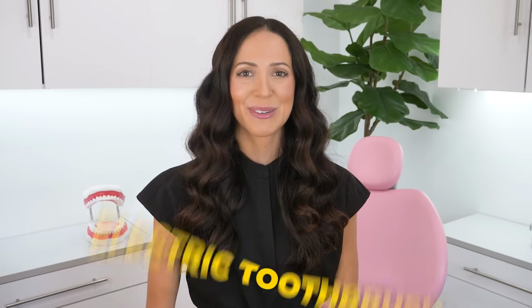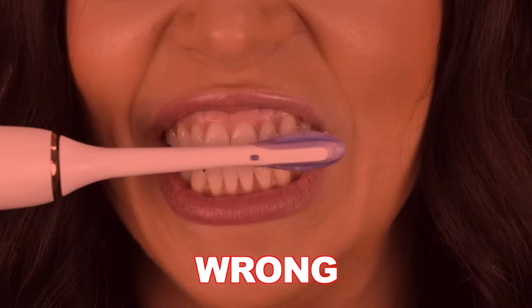And having said that, for today's video, let's talk about brushing with an electric toothbrush. So first things first, let me tell you what not to do. You're not going to scrub back and forth. Really, whether you're using an electric toothbrush or a regular manual toothbrush, you should never scrub brush. Always use gentle motions. But in the case of electric toothbrushes, you want to barely use any motions. You really want to let the electric toothbrush do the work for you.